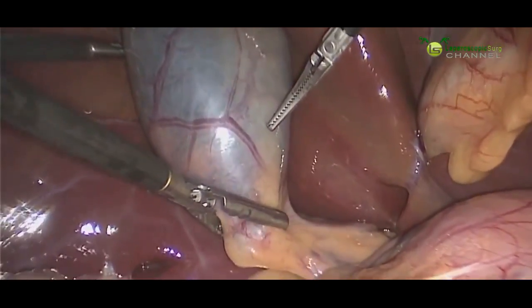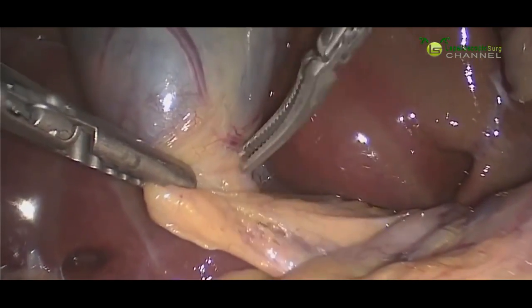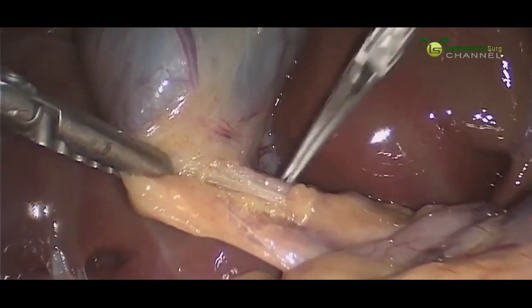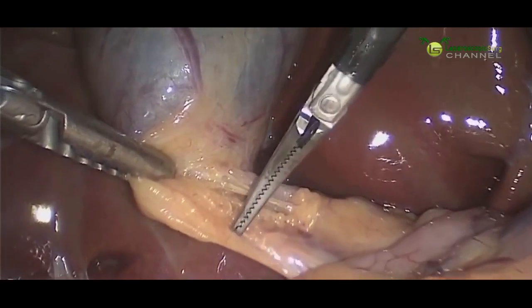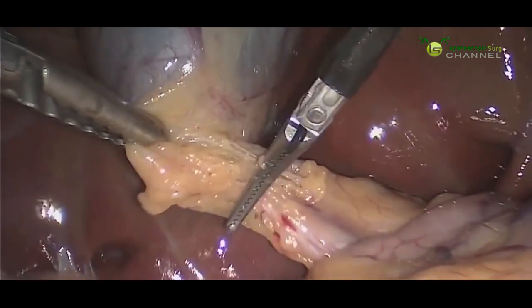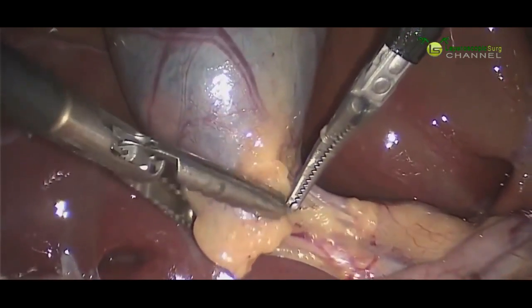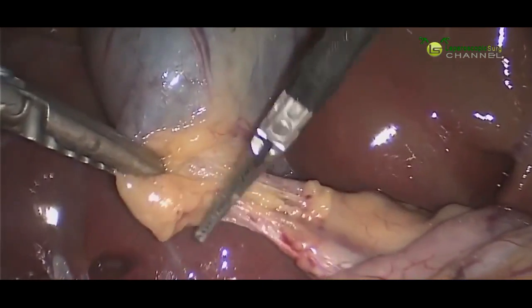You can start to see some of those stones floating around inside the gallbladder. We're going to gently tease away this fat here that's near the cystic duct. The cystic duct is the duct that connects the gallbladder to the main common bile duct.